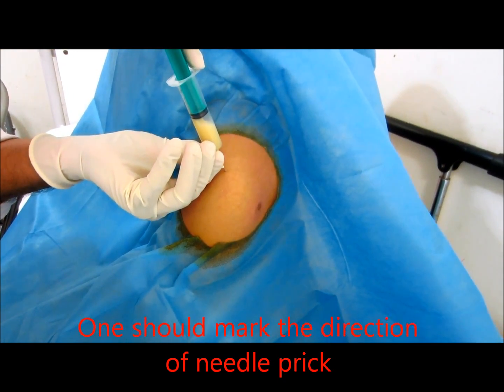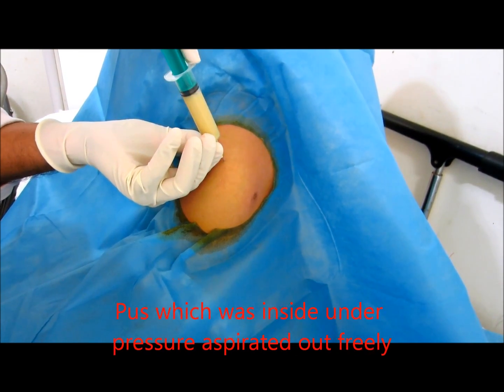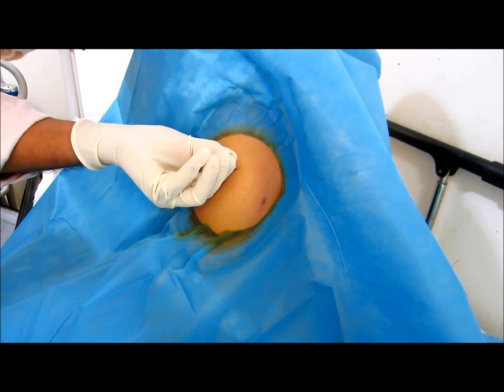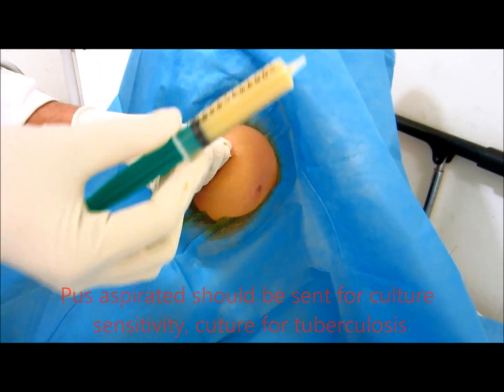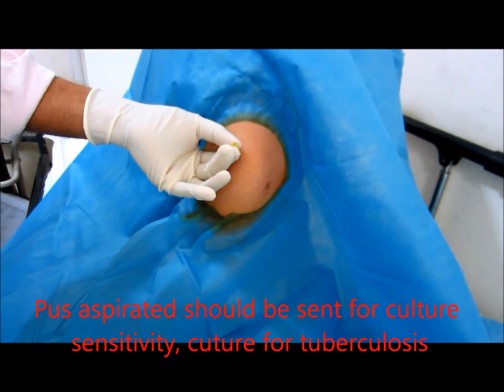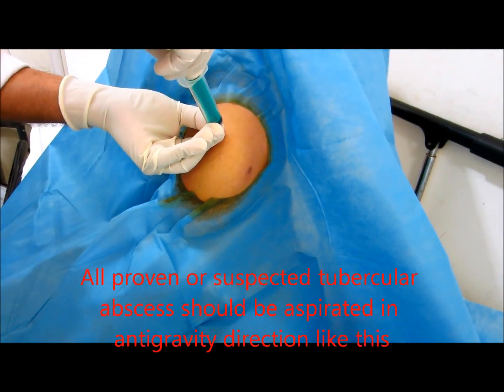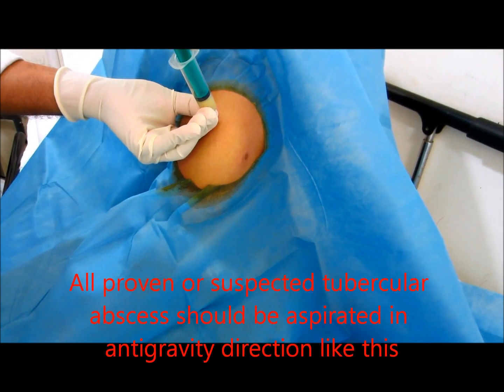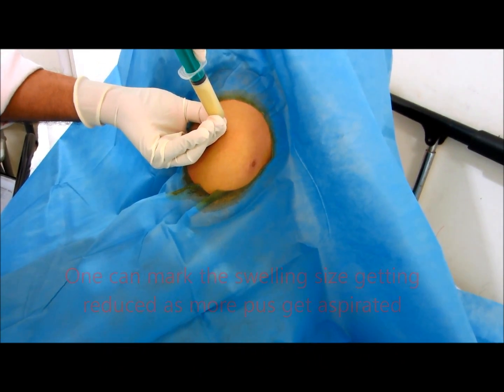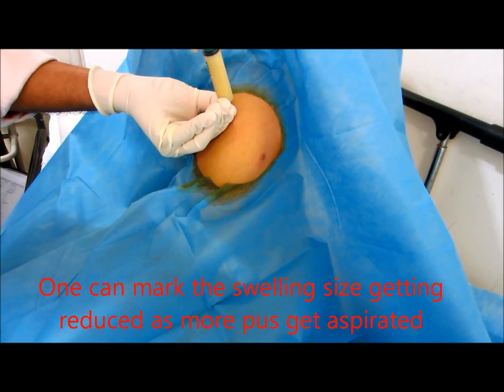One can see pus is coming out freely. The pus under tension inside the cavity should be sent for culture sensitivity, culture for tuberculosis, and for gram staining. All proven or suspected tubercular abscesses should be aspirated in an anti-gravity direction. One can mark the swelling size getting reduced as more pus is aspirated.